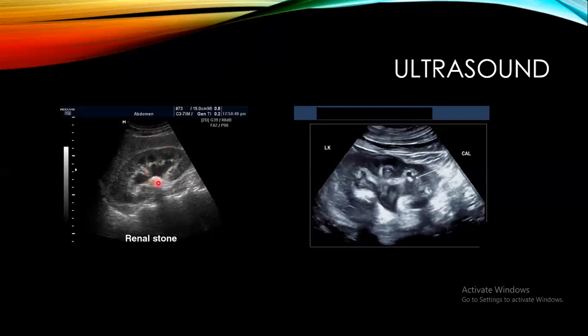بالمقابل المنطقة اللي ورا الحصوة هذه راح تصير free of wave، يعني السونيك ويف ما راح تجي تغطيها، بس راح تكمل طريقها من حدود الحصوة داونورد. وبنفس الوقت بهاي الجهة أيضا يسار الصورة راح تكمل طريقها داونورد أو تسمى الإسكان مالها. في حين المنطقة اللي مباشرة وراء الحصوة راح تصير منطقة خالية من الموجات الصوتية.